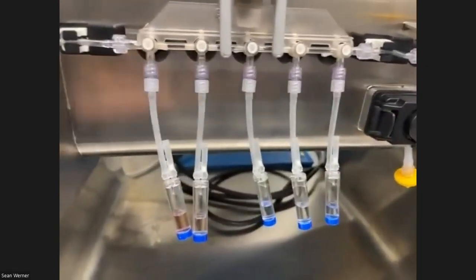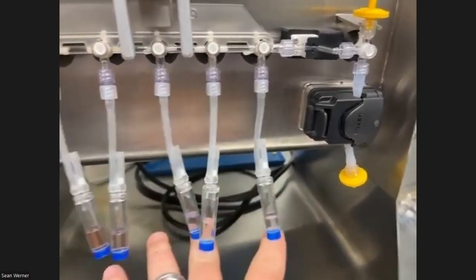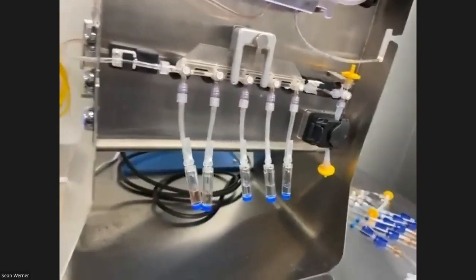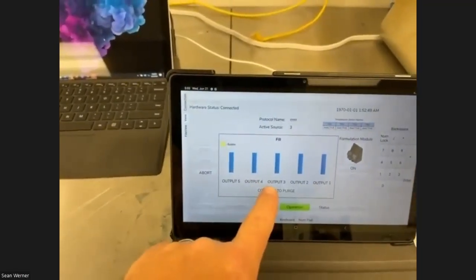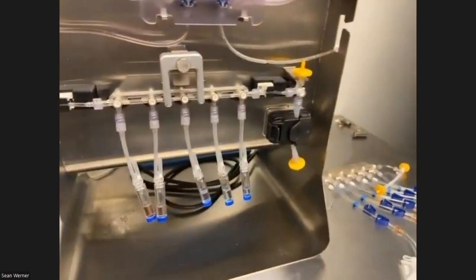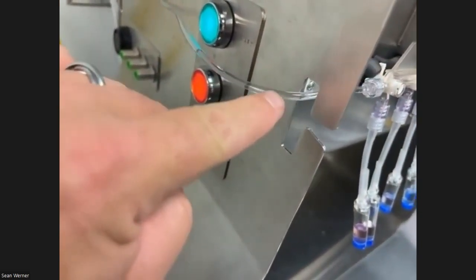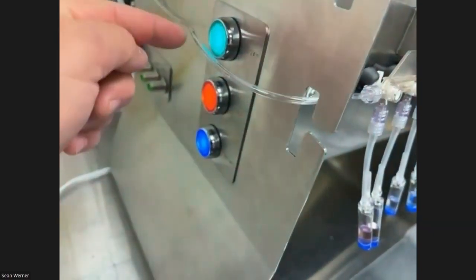Okay, so now those 5 vials are all filled. Looks like they did a pretty good job there, so things look pretty good. I didn't really mix up the food coloring all that well, so there's clear over here to the red. And then it asks, is everything done? If you're going to purge, this purge is just between your first output set and your second one. The idea is that you're going to clear this line so that you have a dry line here to weld the second set to. So now the fluid front is all the way back here.